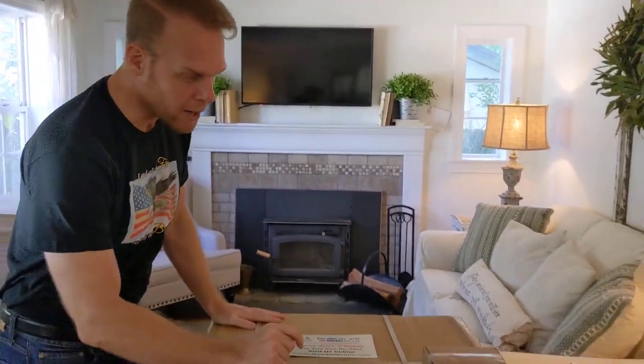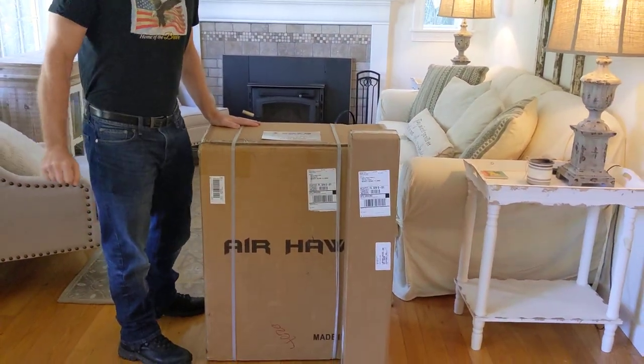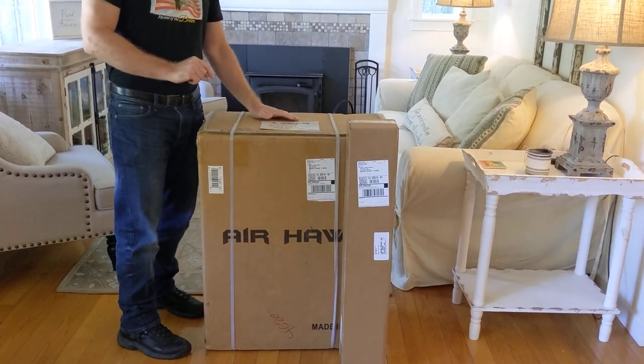Hello, this is Paul from quickenmobile.com, and this is a really happy day because we are going to be unboxing an Airhawk power folding wheelchair. You can see the accessory package as well.